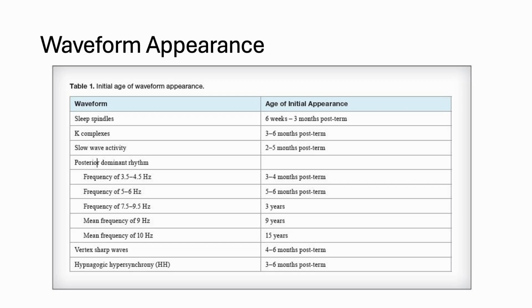Here's a table from the scoring manual on the ages in which certain sleep characteristics appear. We've probably talked about these before, and we're going to talk about them again after this, but it's important to recognize when these things occur so you can accurately detect them on the screen. For instance, a sleep spindle at age 6 looks different than at age 1.